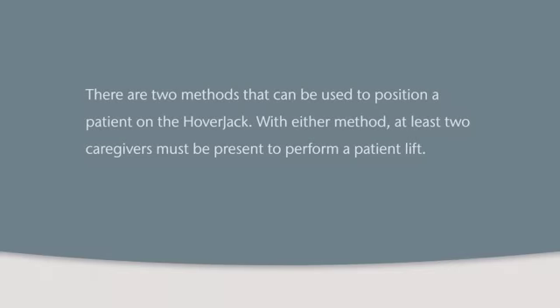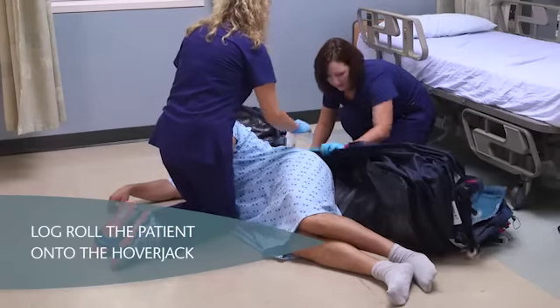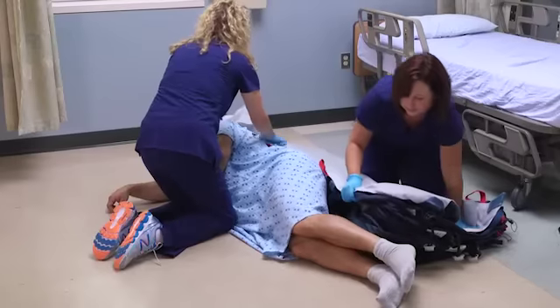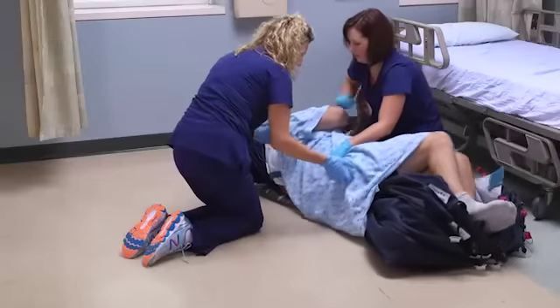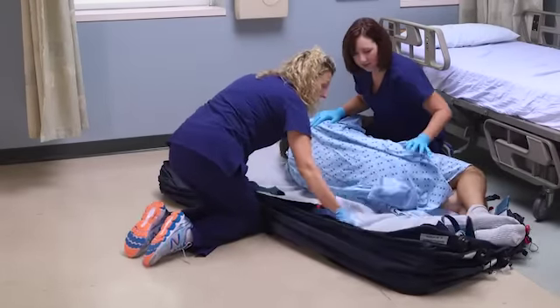There are 2 methods that can be used to position a patient on the HoverJack. With either method, at least 2 caregivers must be present to perform a patient lift. One option is to log roll the patient onto the HoverJack. To do so, place the HoverJack as close to the patient's body as possible. Log roll the patient onto the deflated HoverJack, making certain that the patient's body is centered on the device.